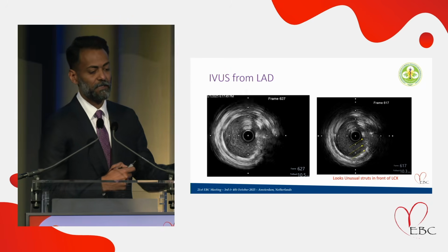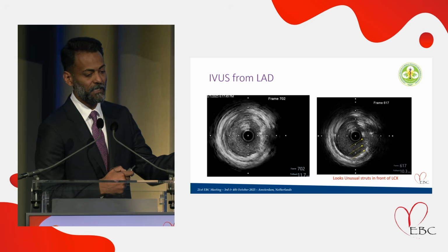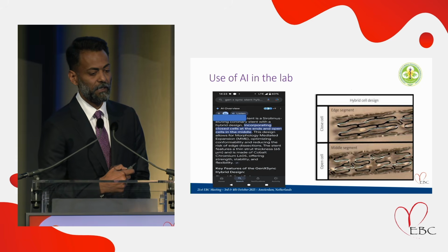So this is the circumflex wire coming in, and this is the before rotablator.